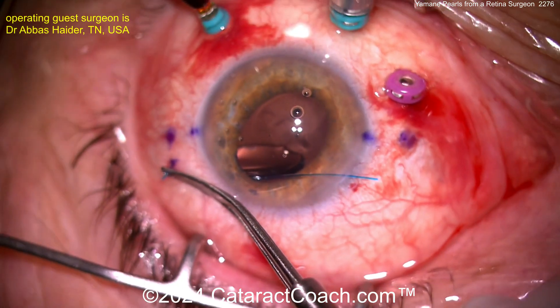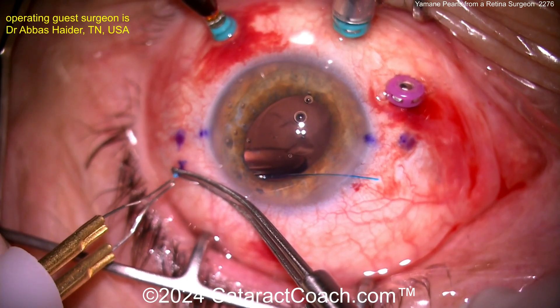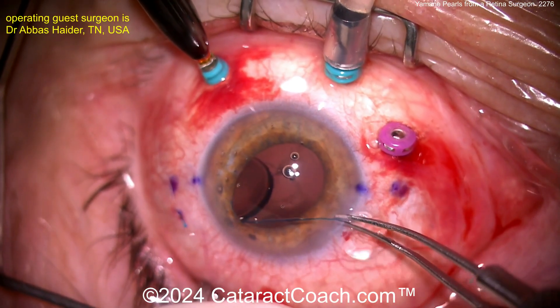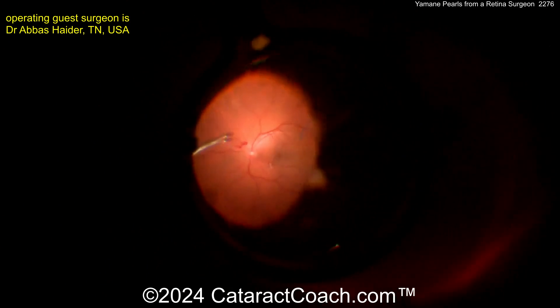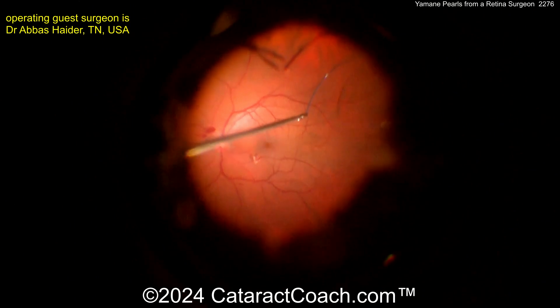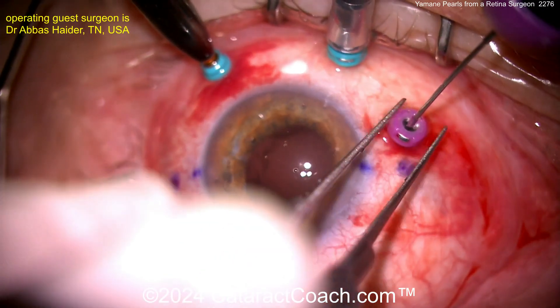The IOL does not touch the retina. You can also adjust this: if you externalize the haptic on the temporal side last, you can have a lot of maneuverability. As he gets the trailing haptic going, he's made a flange on the leading haptic, which is already externalized, and that's going to hold it in place. Looking with the retina viewing system again, there's the haptic in the middle of the vitreous cavity. He grabs it with the micro forceps and externalizes it as well.